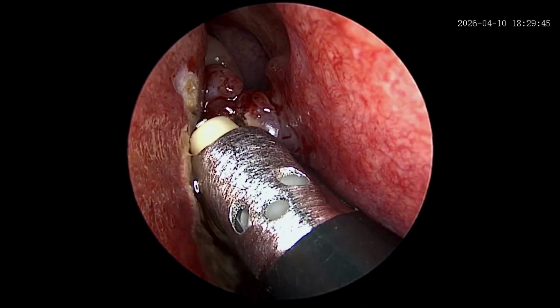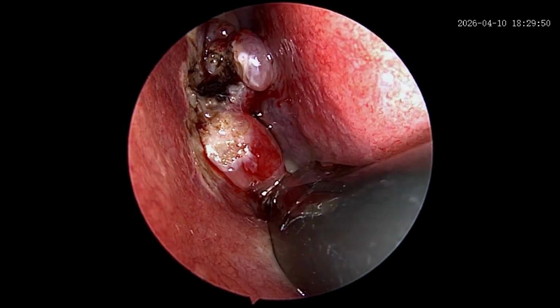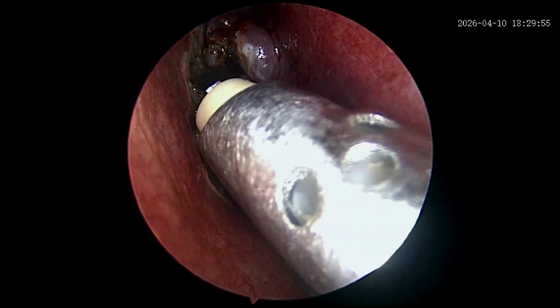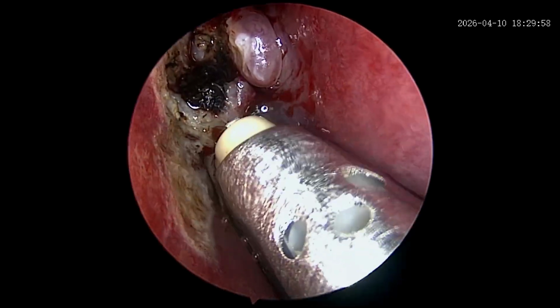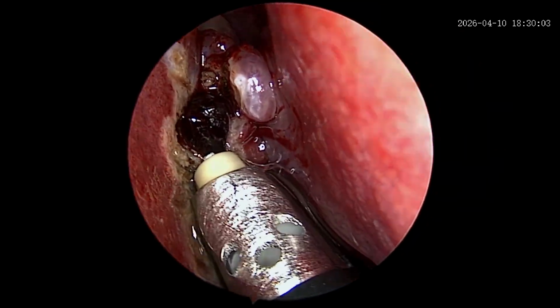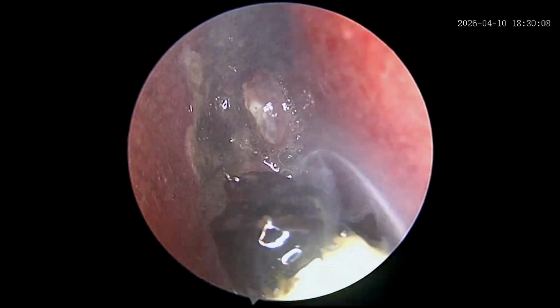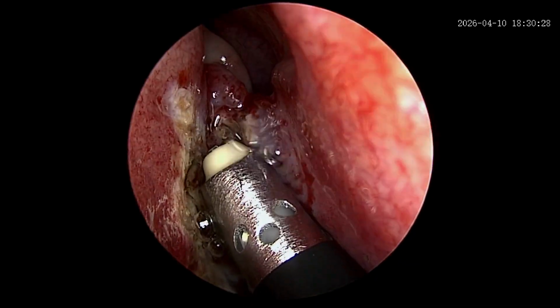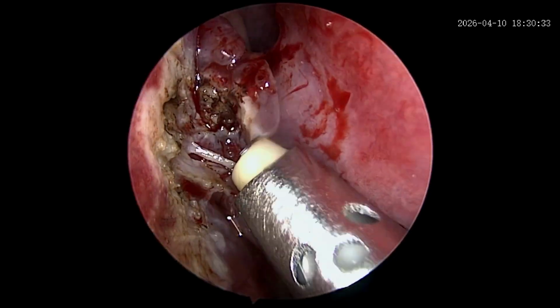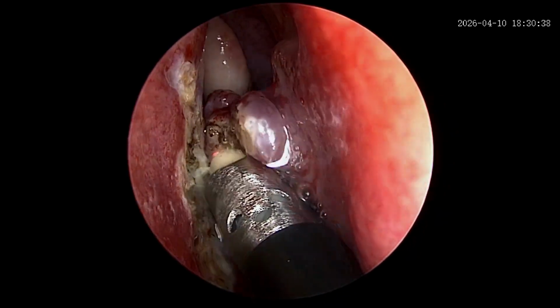Here we are using ablation mode to cut off the nasal mass. The beauty of the Coblator is that it can do suction simultaneously, so the nasal saline or the blood in the field gets sucked out and keeps the field very clear for further dissection.